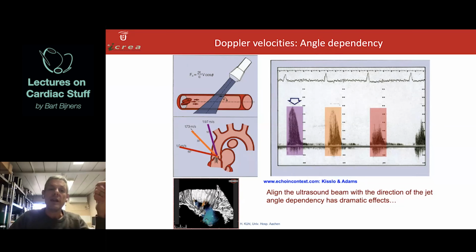With MRI 3D flow, or 4D flow, as they say, as a function of time, you can partially avoid this. Then you can really look at the right angle, the angle that the vector has, so the really 3D vector. The problem, as I said before, is potentially the temporal resolution. Because of lower temporal resolution, you might miss a peak. So there again, these are complementary techniques in some ways.